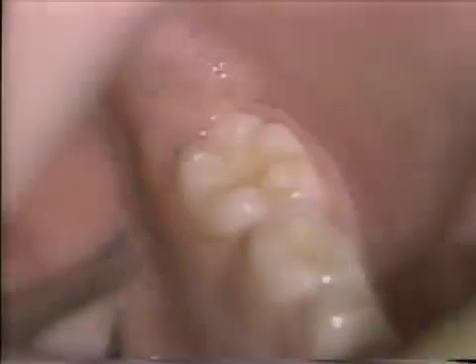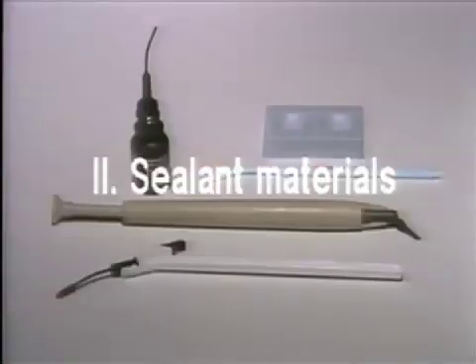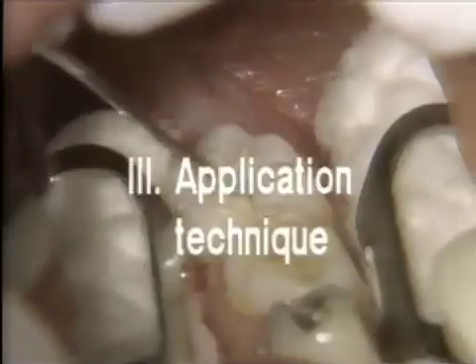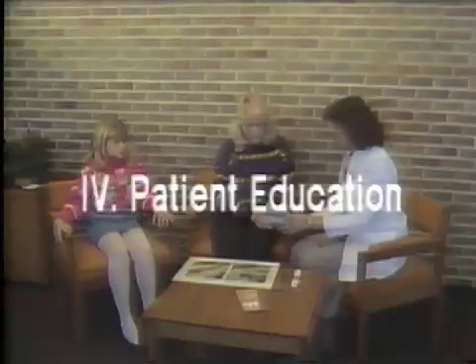The objectives of this videotape were to present the rationale for sealant use, to demonstrate sealant materials, to demonstrate a sealant application technique, and to describe methods of patient education about sealants. Including fissure sealants in the preventive armamentarium of a dental office ensures the likelihood that young patients can enjoy a lifetime free from dental caries.